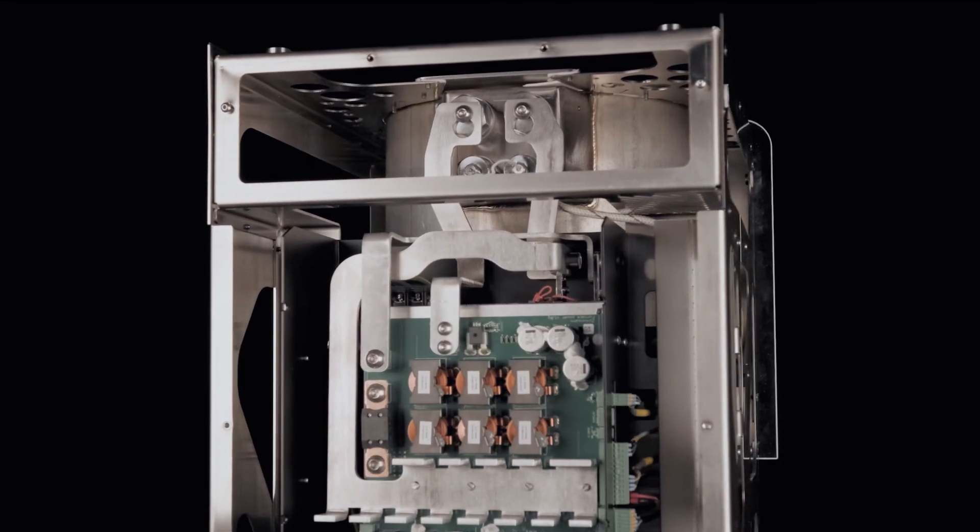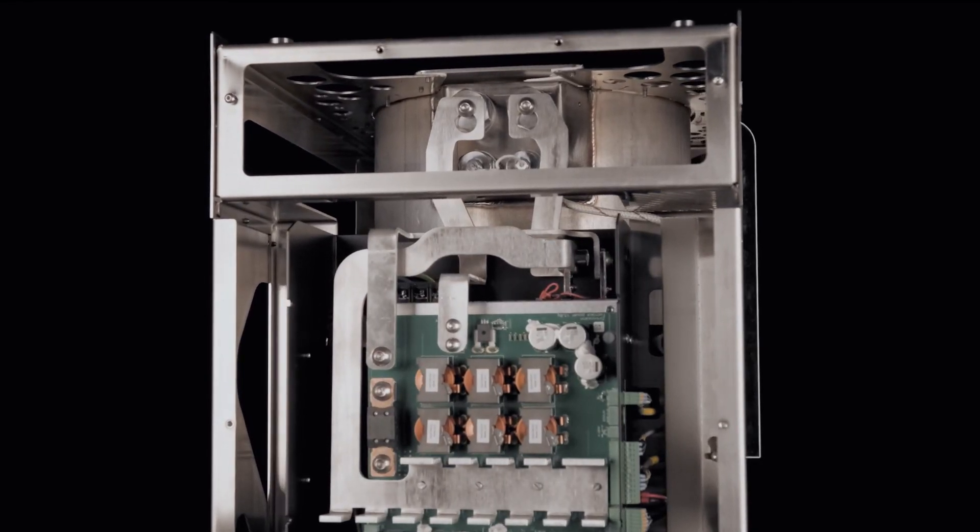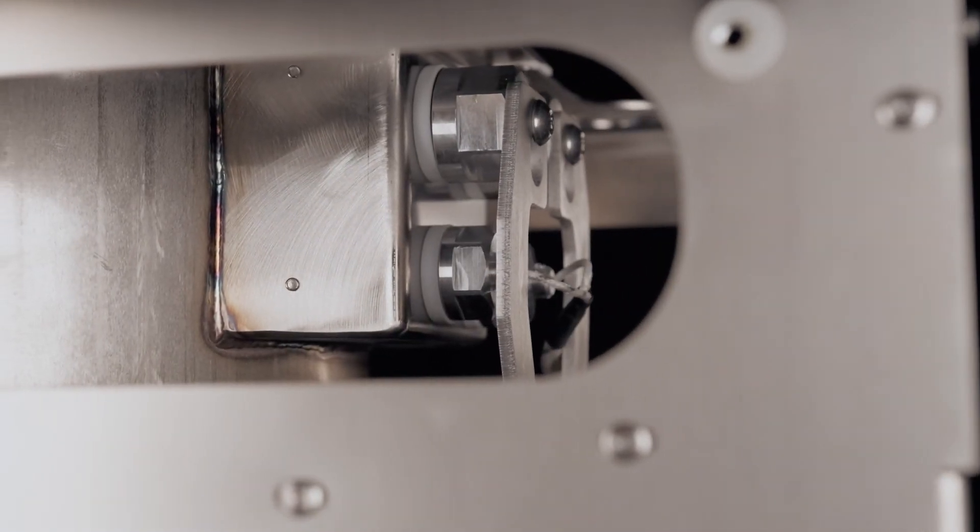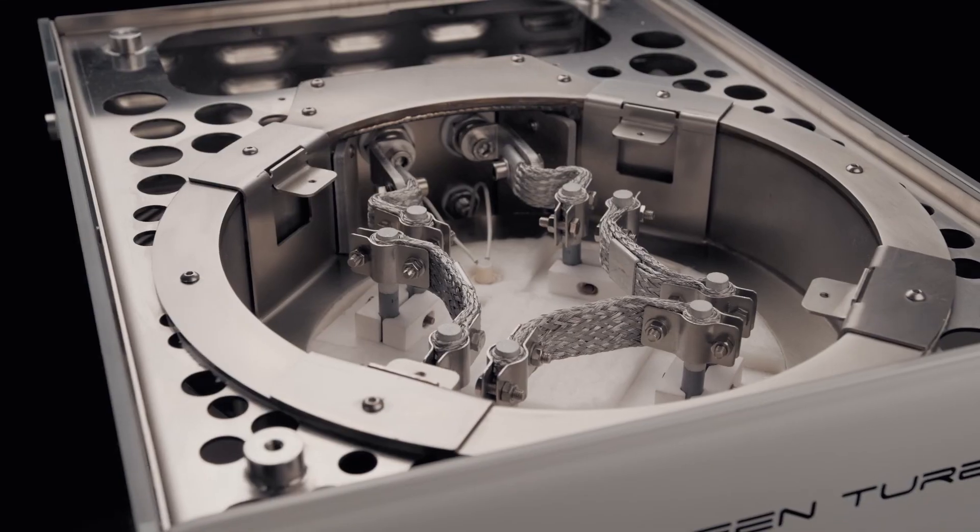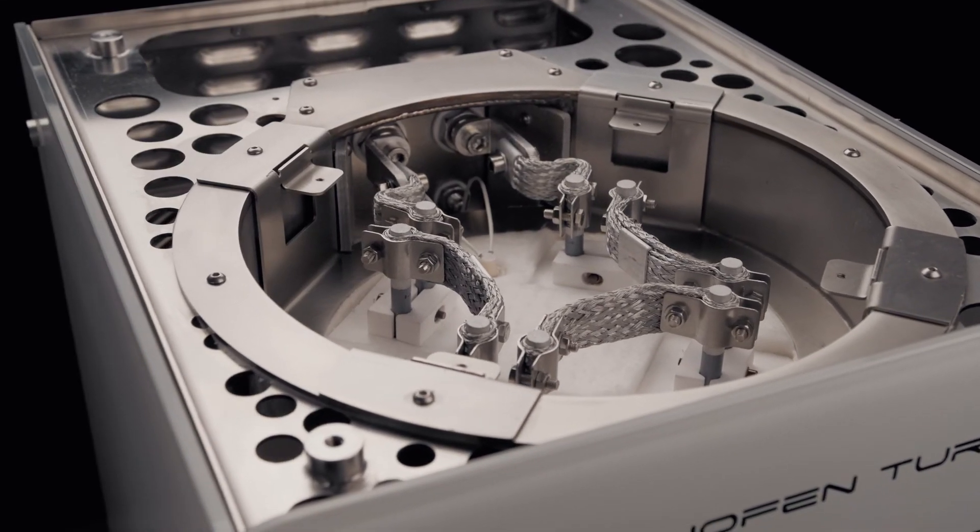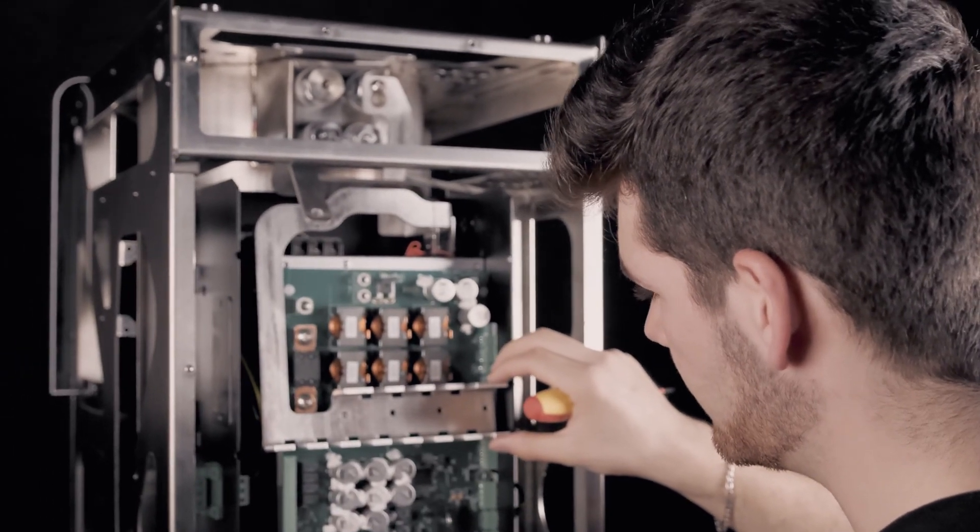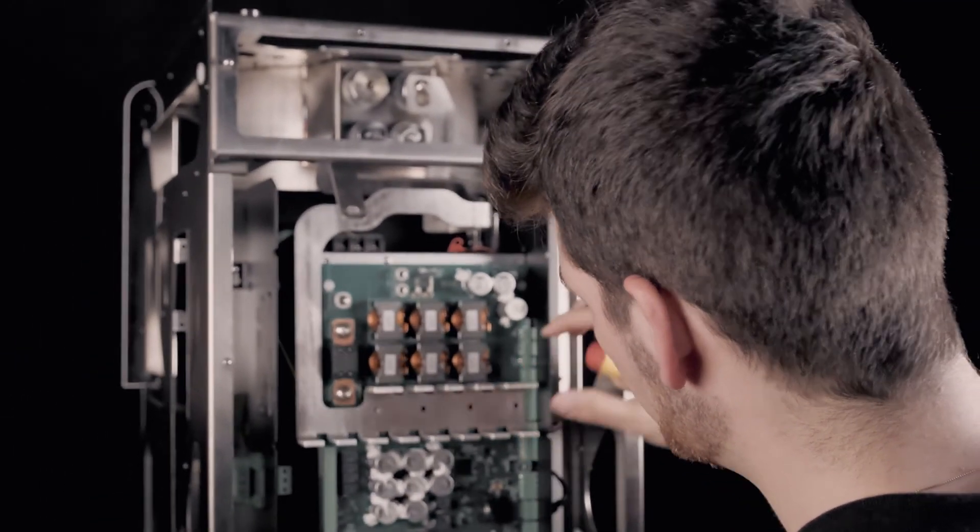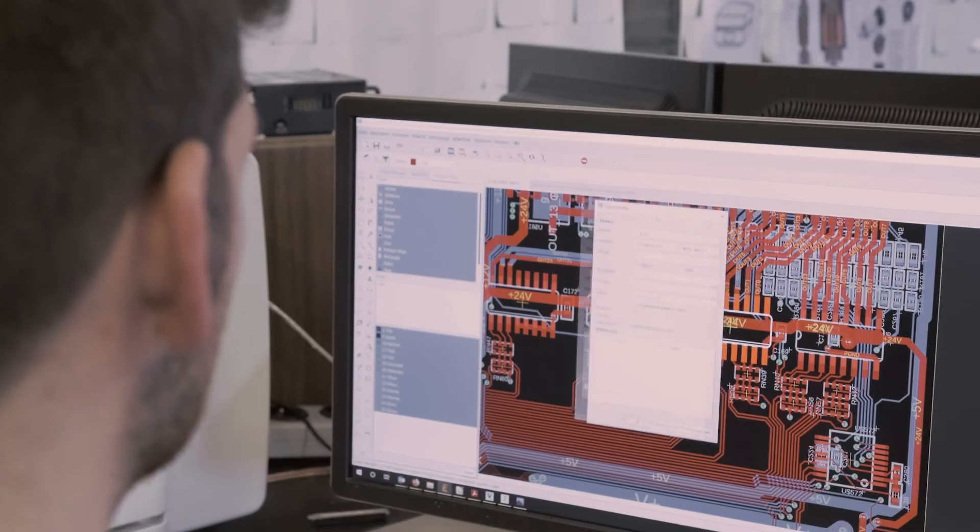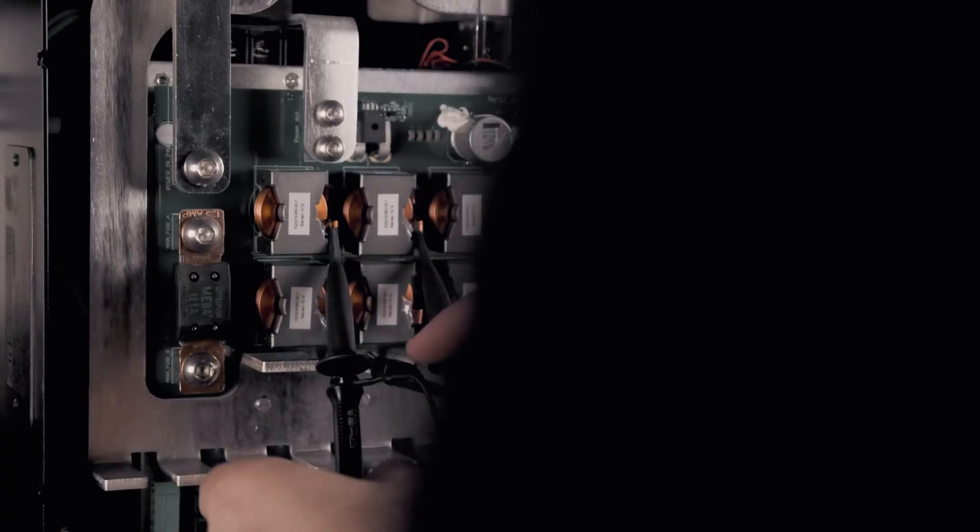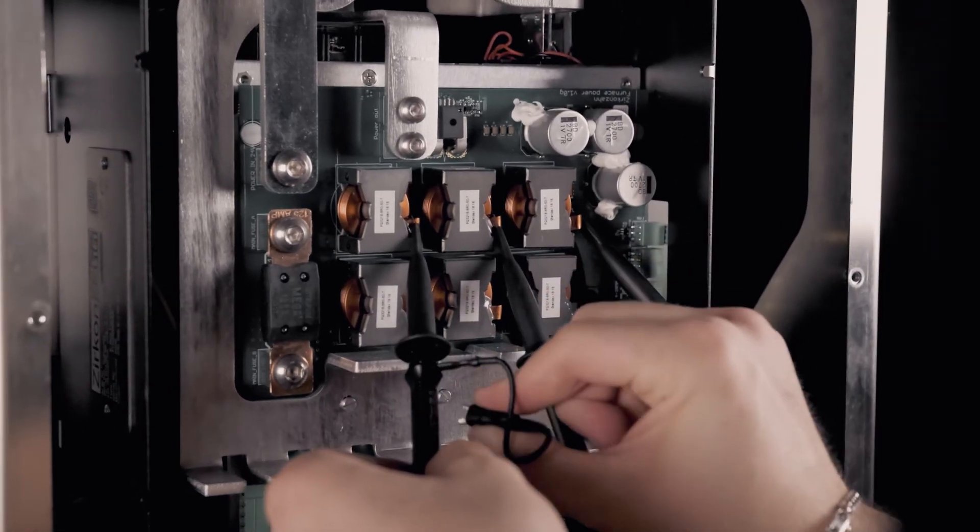Zirkonzahn Turbo proves once again our attention to detail and our constant search for perfection and innovation. The furnace consists of a robust stainless steel frame with specific aluminum electrical conductors which connect the electronic components to each heating element. We have also optimized the length and cross-sectional areas of the electrical conductors by designing them specifically for our furnace in order to reach efficient and excellent current conduction.